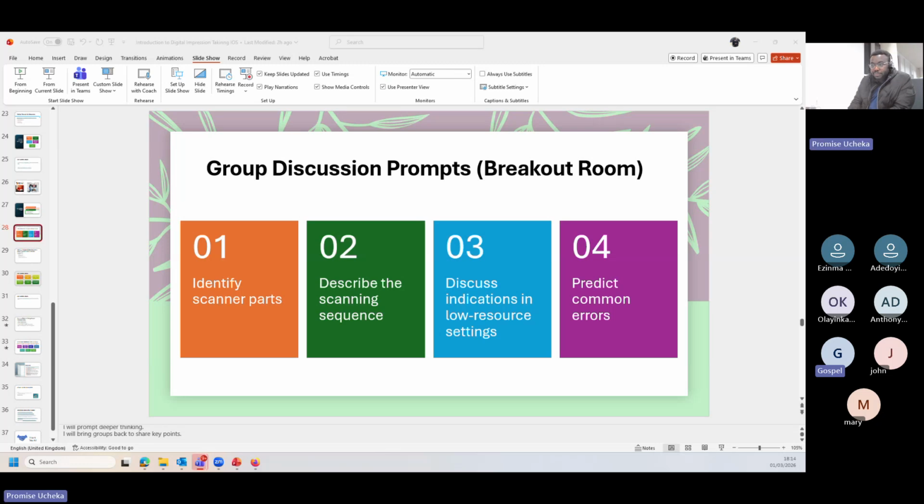Sometimes you buy materials and keep repeating and generate waste. It reduces waste in the environment, since most clinics have to pay every time they dispose of their waste, and all those environmental concerns.